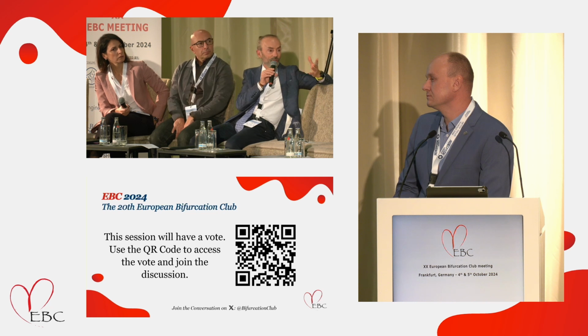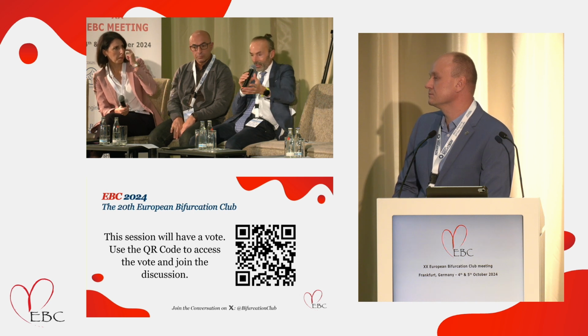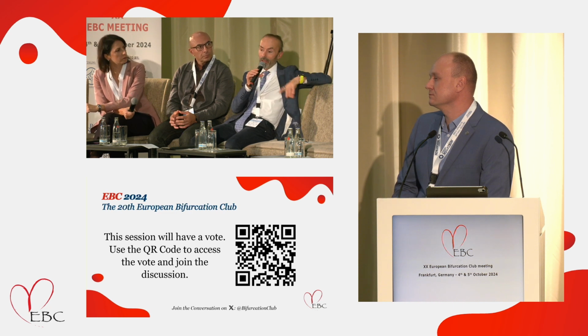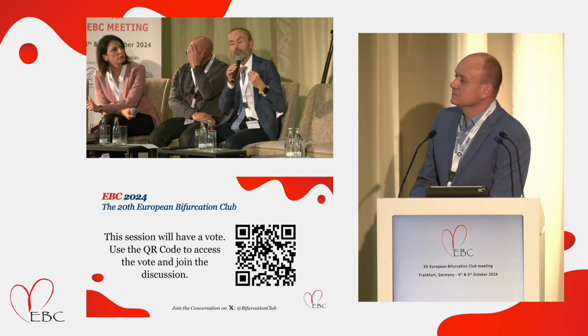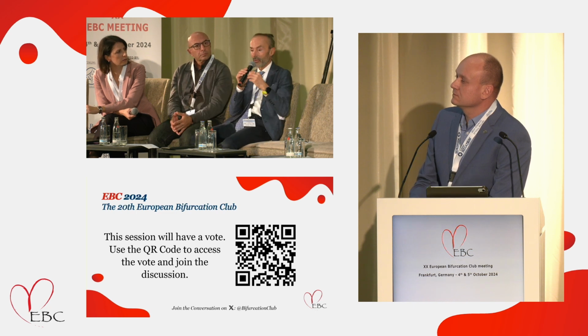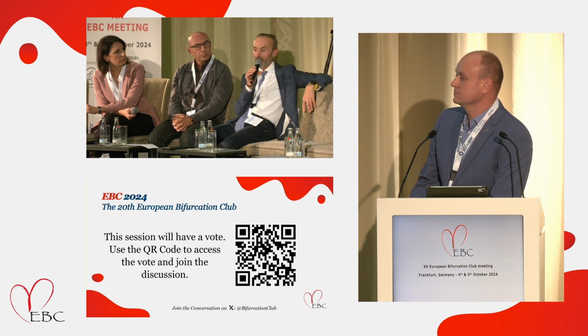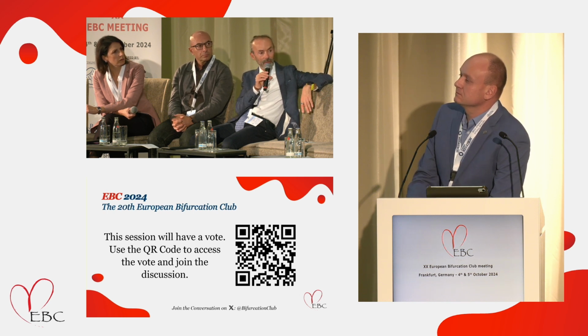So one strategy in this case could be a rotablator at the beginning, just to create some space, IVUS or imaging anyway to see and try to go in the circ, and then go directly to IVL without trying to open it. If there is a nodule of calcium, probably IVL is the only way because it's bigger than a small rotablator burr, bigger than an orbital atherectomy, and can crack something, and then go with the procedure, predilatation, etc.